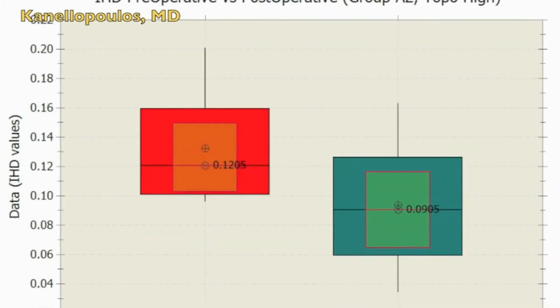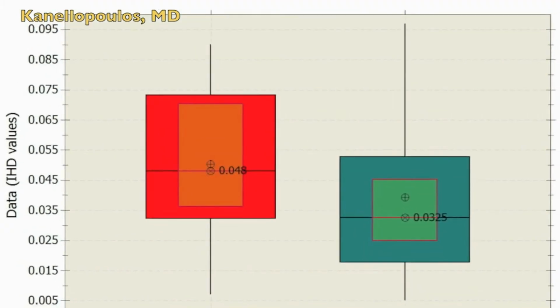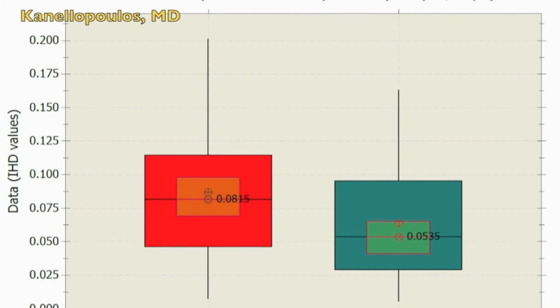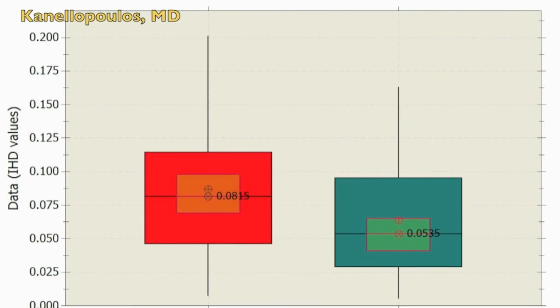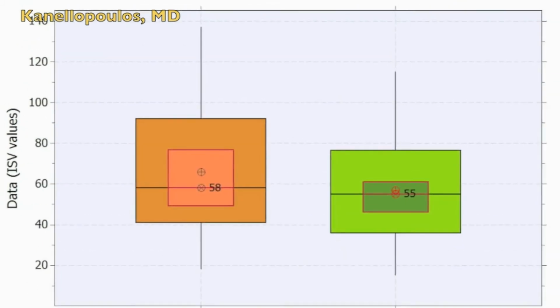studied topography-guided treatments that were combined with higher fluence collagen cross-linking, the technique that we call the Athens protocol, in treatment of progressive keratoconus in young keratoconic patients. The data are quite impressive in all the parameters studied.